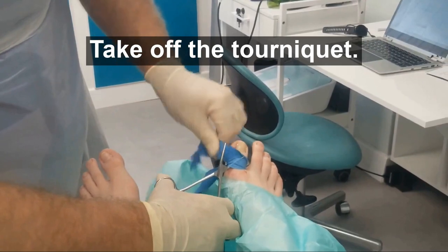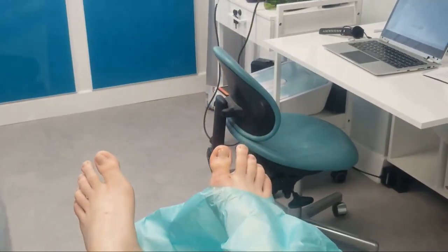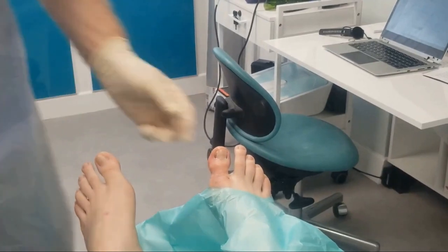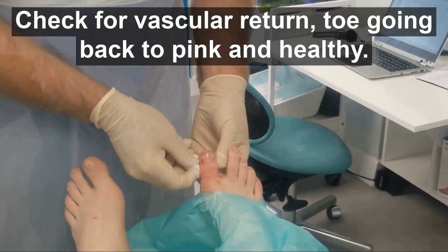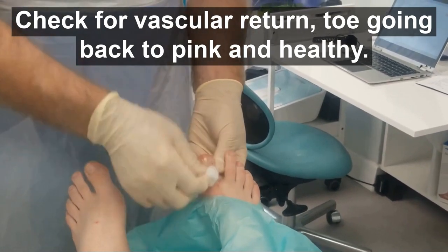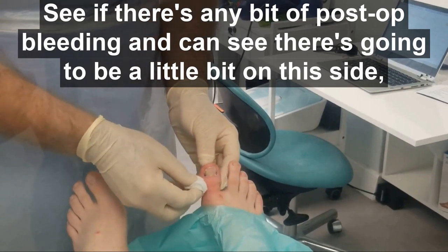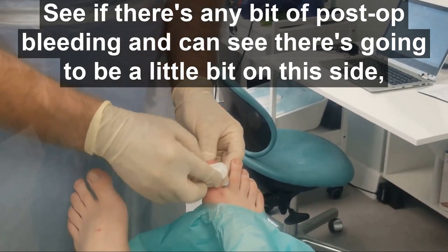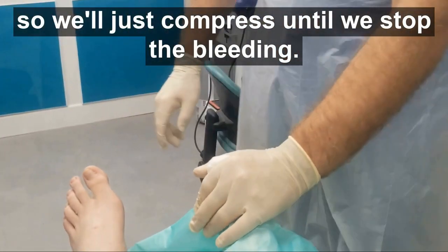Take off the tourniquet and check for vascular return — toe going back to pink and healthy. See if there's any post-op bleeding; you can see there's going to be a little bit on this side, so we'll just compress until we stop the bleeding.